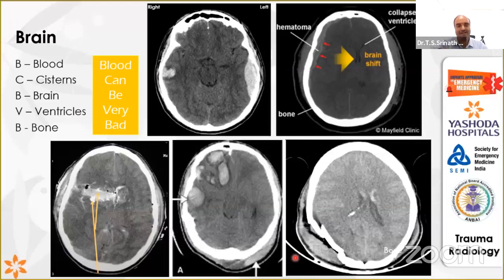Next slide, please. Yeah. So whenever you're looking at an X-ray, what kind of view is important? When you're ordering an X-ray, what type of X-ray do you want? If it is cervical spine, what do I want? I want AP view, I want lateral. When you're looking for a chest X-ray, either you can get AP view, PA view, dorsal view or lateral view. So which view do you want? If he's unconscious, you cannot make him sit and take a PA view, correct?